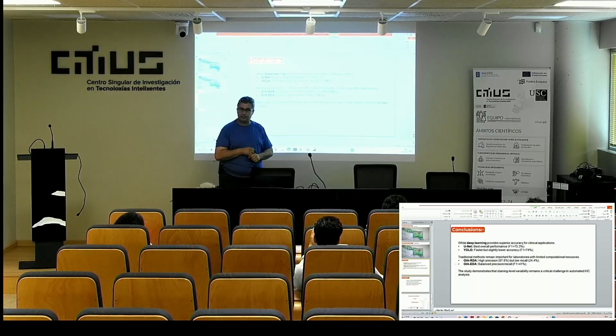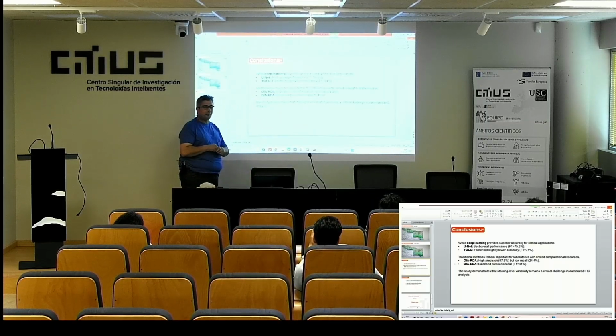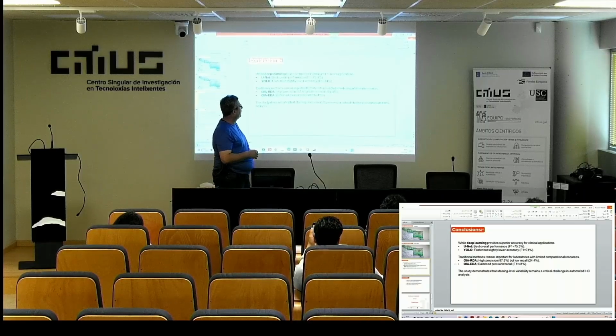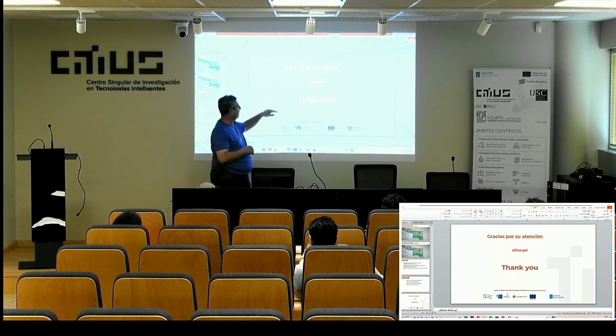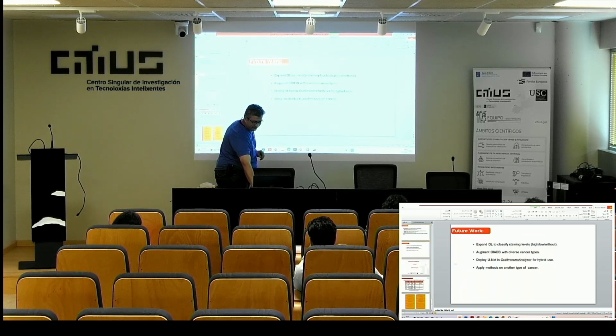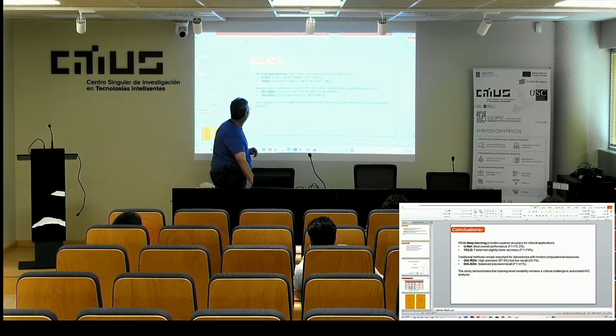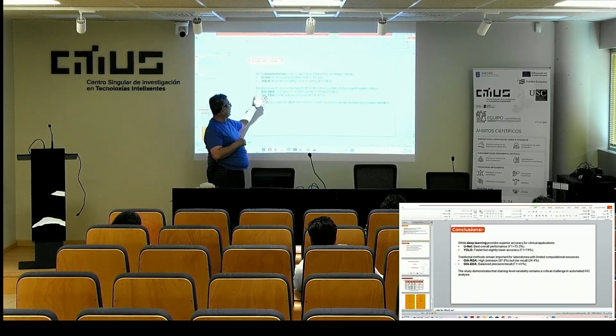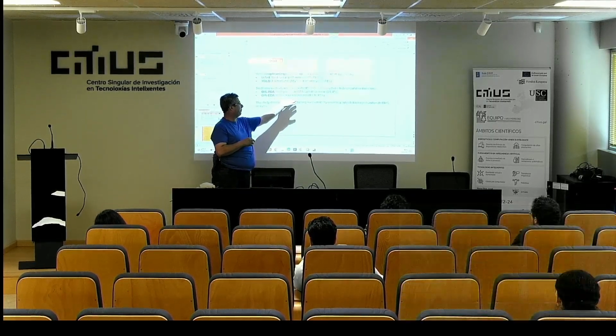They do not need labeling, but unfortunately they have low accuracy. We find that region detection gets high precision but low recall, and edge detection balances precision.